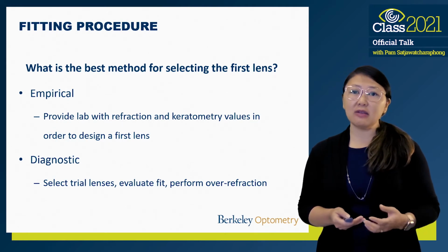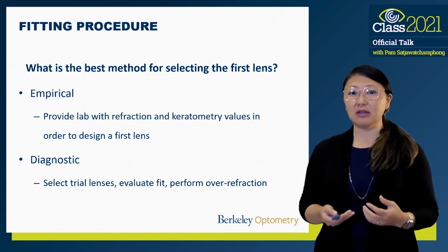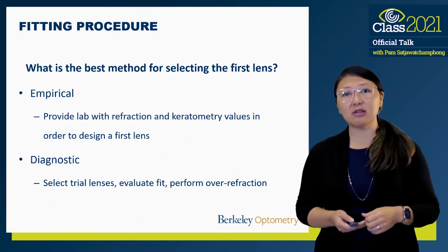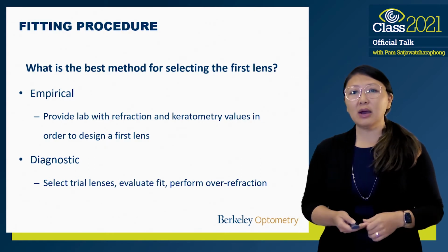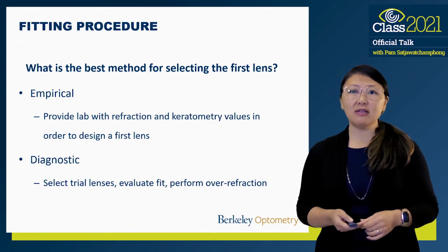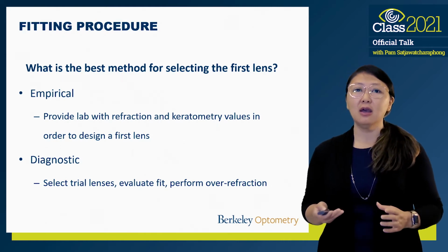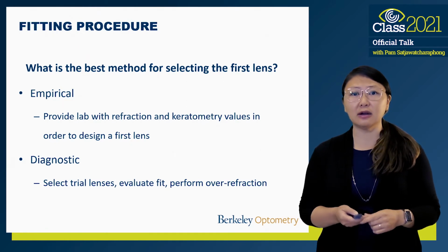I would say the downsides are that I think there's some benefit to having the patient experience what the lens feels like in office, but additionally, it's easier to see how the anatomy, such as the upper lid, will interact with a lens if you actually put one on. So I like to tell my patients that may be opting for an empirical fitting that this is going to act like a first trial lens because we will likely need to make some changes afterwards to get the best fit that we can.